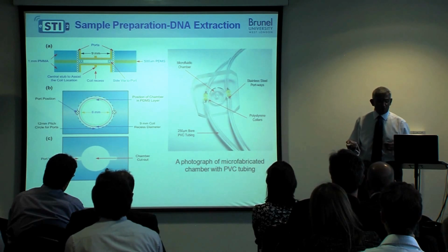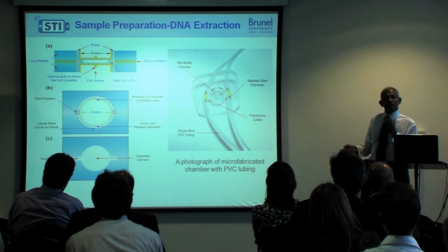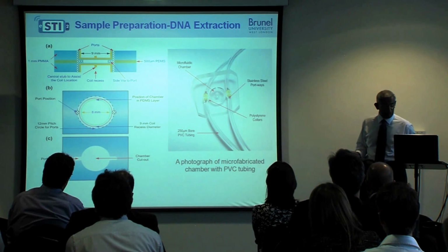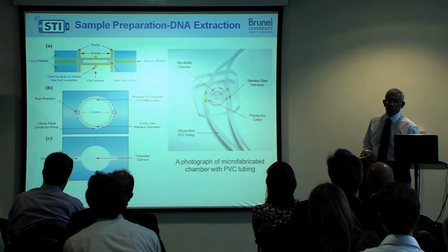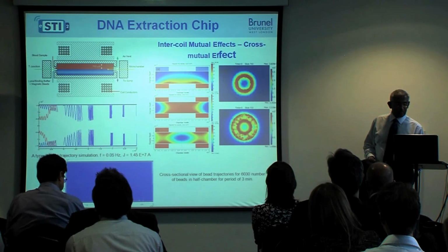These are well-known techniques that are nowadays utilized by many people, but the challenge is how fast you can do it. And what we managed to demonstrate is that you can do it in about 4 minutes from sample input to the DNA extraction.